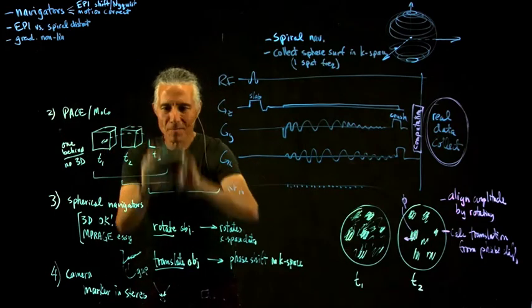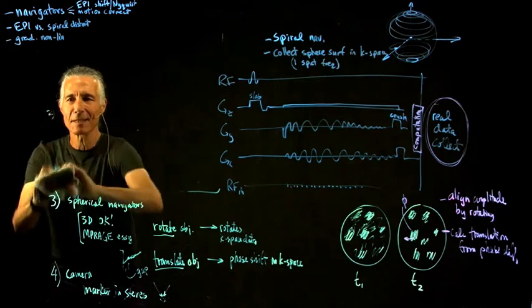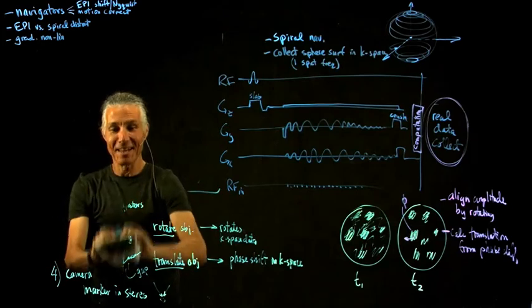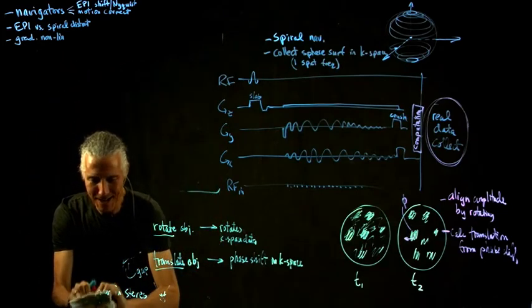So you can see motion is a serious problem. That's why I like to sometimes scan dead things. You can scan them for 24 hours, and as long as you got it battened down, it's not going anywhere.